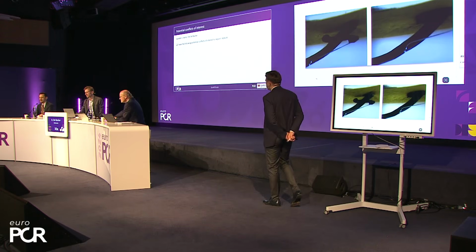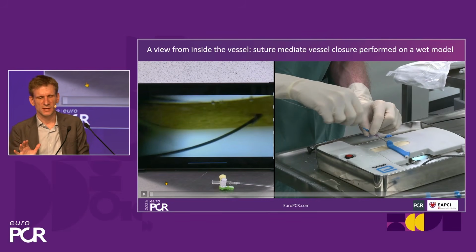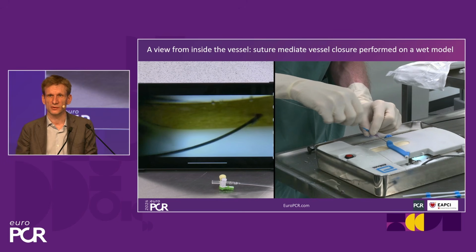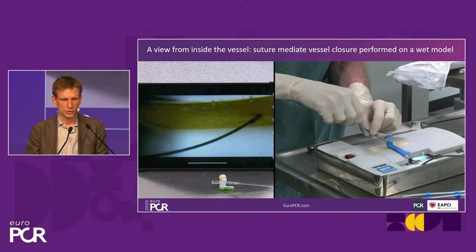But it's interesting because before you use a device, any device, I would say, as an operator, it's really smart that you understand fully how this device works. If you understand what it's actually doing when you're moving a certain knob or pulling on a certain knob, you will get more success, yes?